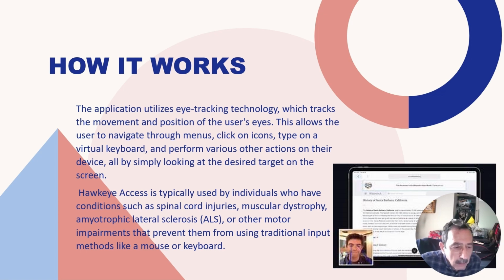HawkEye Access is typically used by individuals who have conditions such as spinal cord injuries, muscular dystrophy, amyotrophic lateral sclerosis, or other motor impairments that prevent them from using traditional input methods like mouse or keyboard.